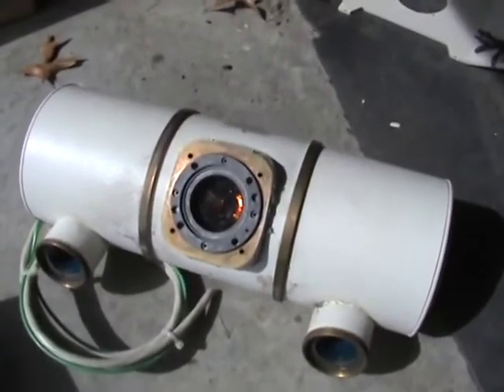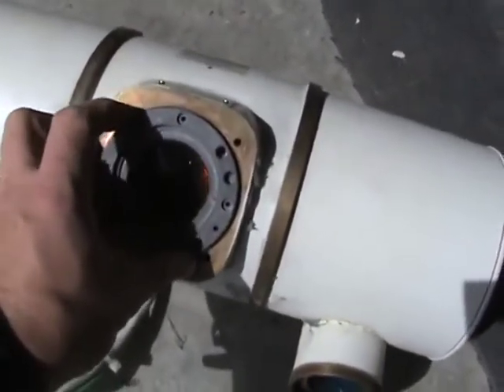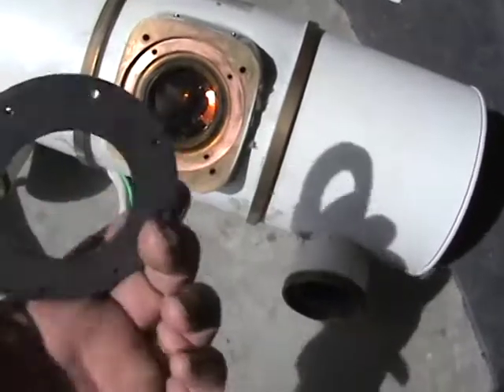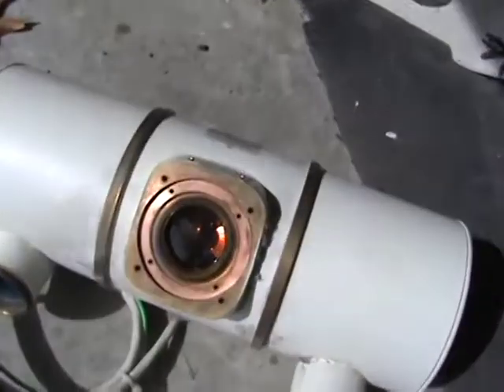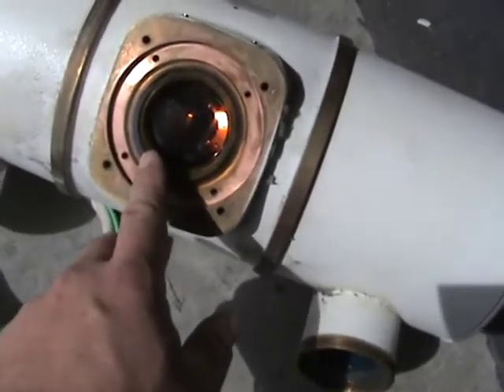Here we are again. I've taken the hex bolts out - those turned out to be metric by the way, so I had to go get a different wrench set. Here goes this metal ring - that thing is very heavy. I'm not sure if it's made out of lead or if it could just be steel.